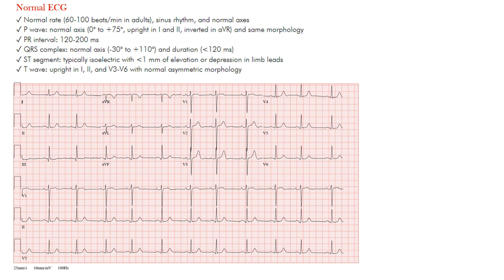The first thing we want to look at is a normal ECG. If you pulled up the coding reference guide you'd see this, and you have that example right there. Let's walk through what is a normal ECG, because it's really important to understand normal — a lot of your teachers will tell you this and it's true — because then you can start to pick up on abnormal findings. With a normal ECG you want to have a normal rate, meaning the normal ventricular and atrial rate in adults is between 60 and 100 beats per minute.